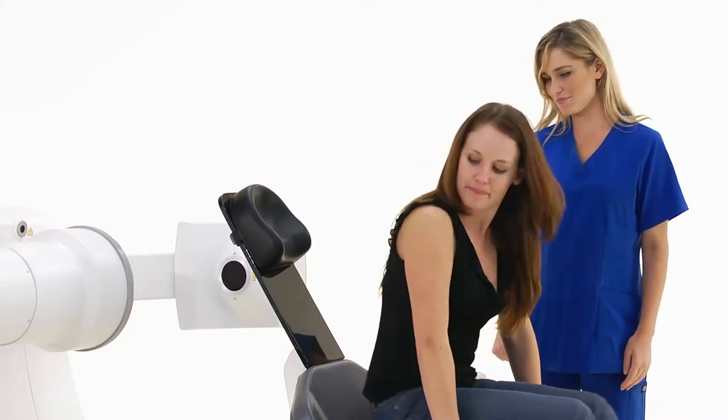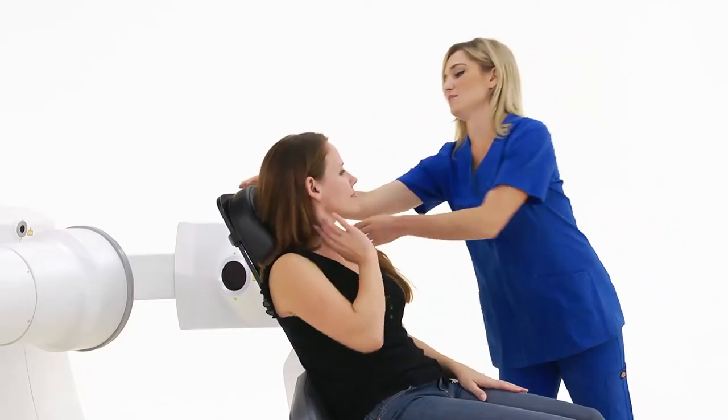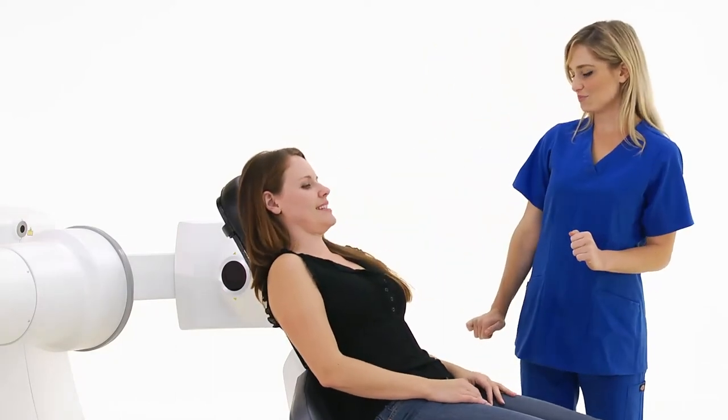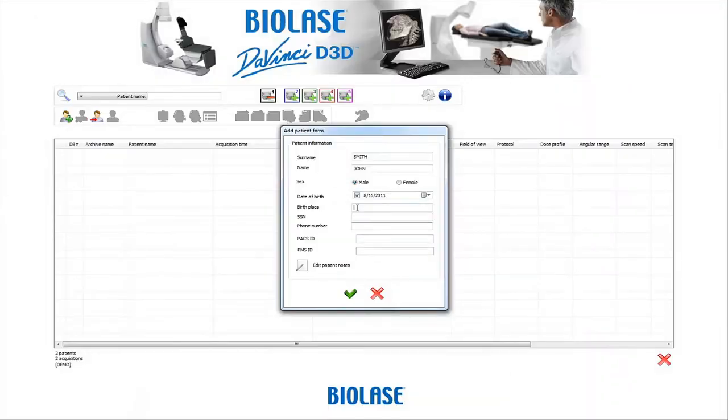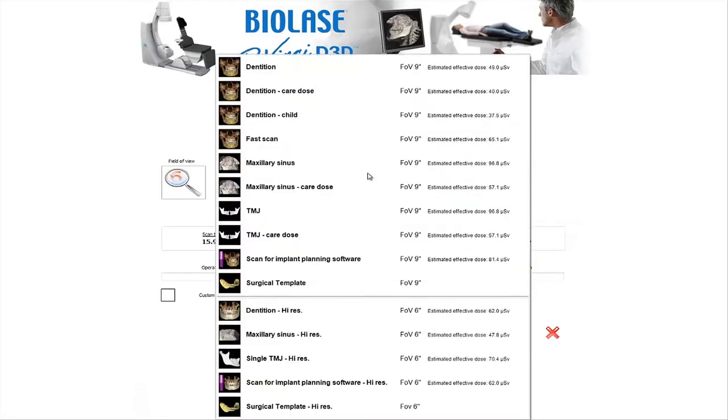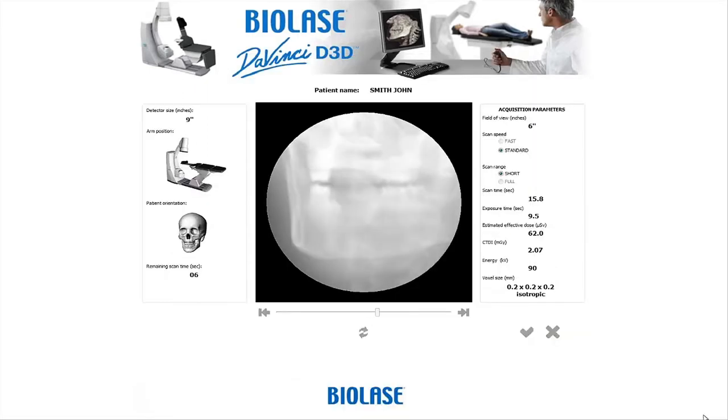With no need for straps or restraints, the patient simply reclines into position, saving preparation time for the clinical staff. Patient data is entered into the software, creating a study file. You can select the appropriate field of view and exposure time, tailoring the x-ray dose delivered to the patient — minimizing radiation exposure and providing optimal image quality at a lower dose.